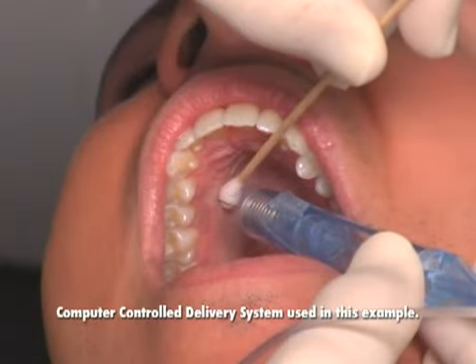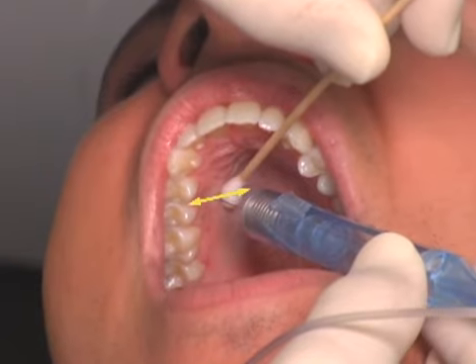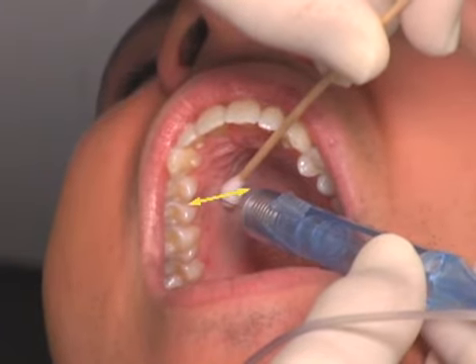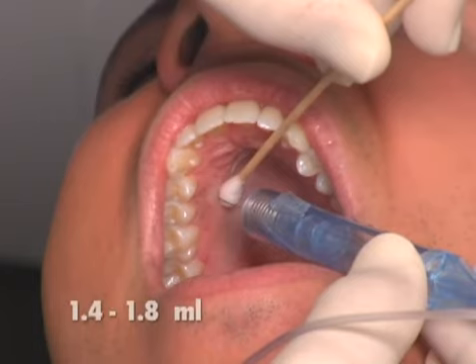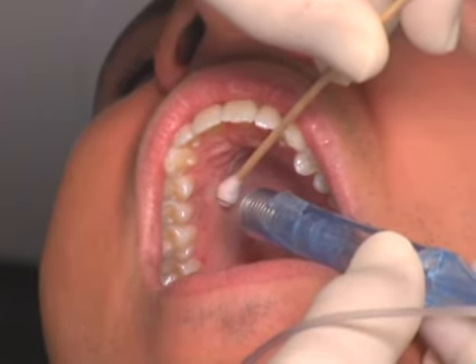The needle is inserted into the tissues at a point halfway along the line between the premolars and the midline of the palate. 1.4 to 1.8 mL of anesthetic is slowly deposited.